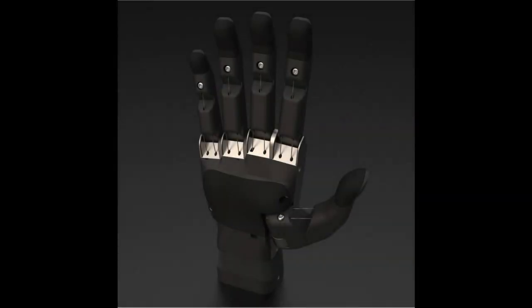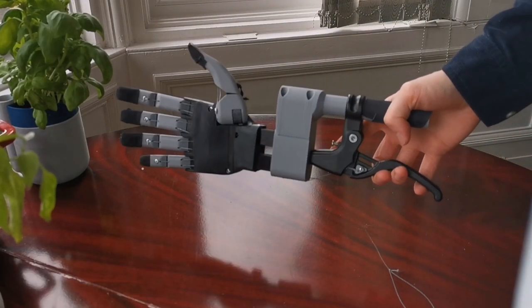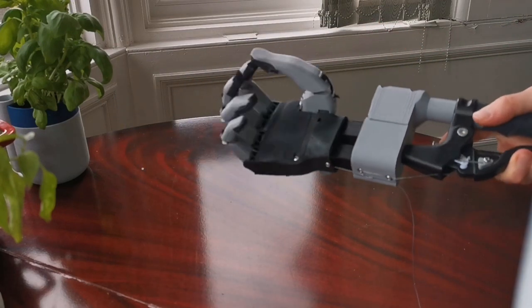This is a quick update video to show where we are at with our latest prototypes — this being the azimuth hand, which we printed out and assembled alongside our new handle system so we can operate it single-handed just like a user.